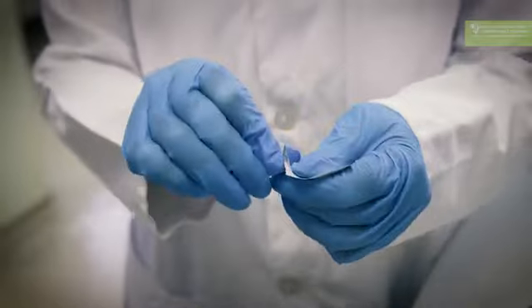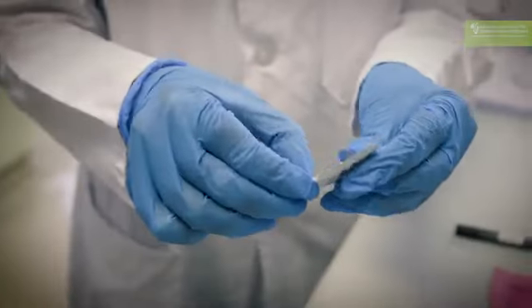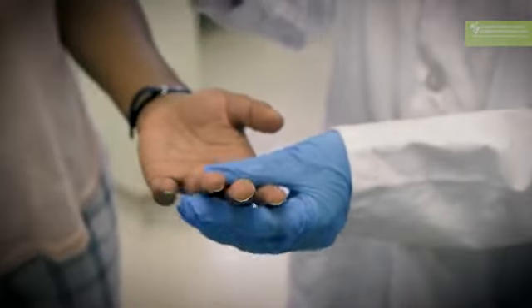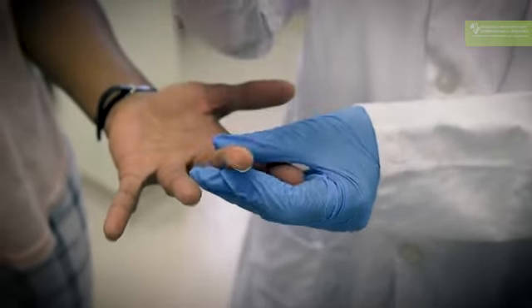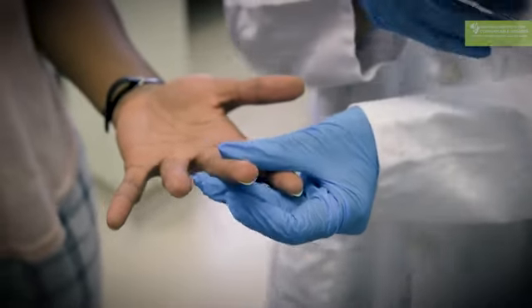Once you have selected the finger, you need to clean the finger. You use the alcohol swab to clean the finger. So you need to first tear open the alcohol swab. You get the hand, and you move from mid finger in one swoop over to the fingertip to make sure that you have cleaned the finger. You let the finger dry, and then you are ready to start the test and get the lancet ready.